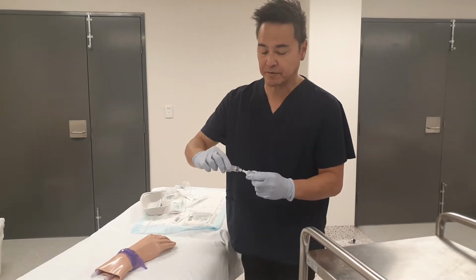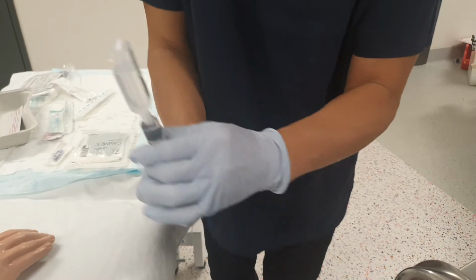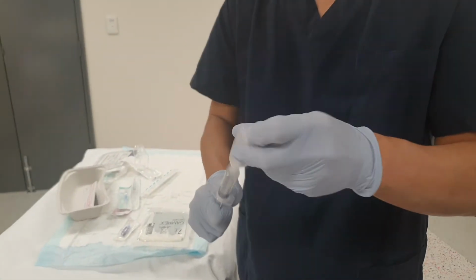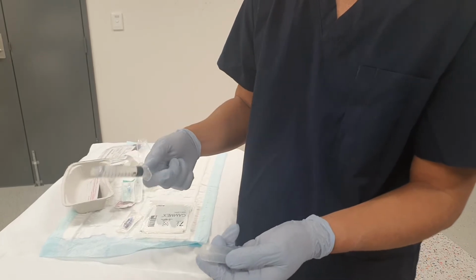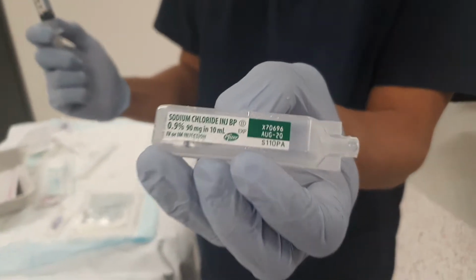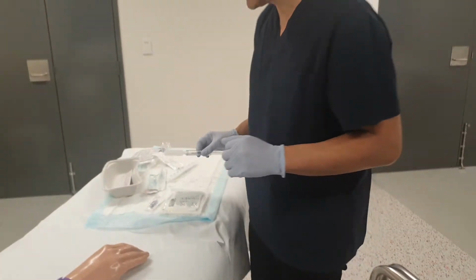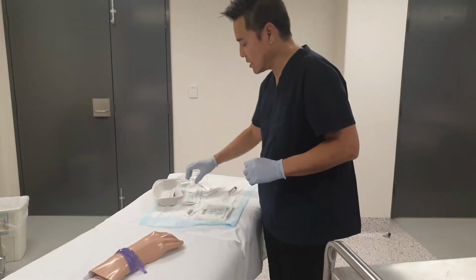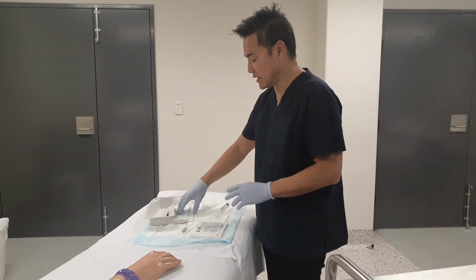Okay, so drawing up the flush, remember, screw that in. Drawing it up, getting the flush checked, right? Ideally, you should be getting somebody to check the flush with you 3 times. I like to just screw that in to protect my syringe, all right? So now I've established where I'm going to be putting the cannula in. I'm going to go and grab my equipment.